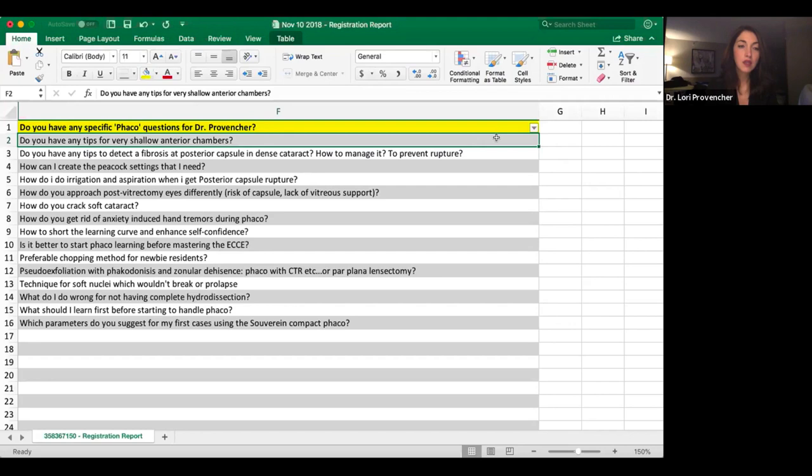If there is a small pupil or any sort of synechiae, oftentimes they'll have synechiae, posterior synechiae, I would err on the side of using hooks over a ring. My threshold is usually a 21-millimeter eye or smaller. I will opt to use hooks instead of a ring because you just get so much crowding and the ring is a little less predictable. And then just during nuclear disassembly or before I start nuclear disassembly on these cases, I will re-inject dispersive viscoelastic. And just taking it slower and being more mindful. A lot of times their chamber is shallow because they have zonular weakness.